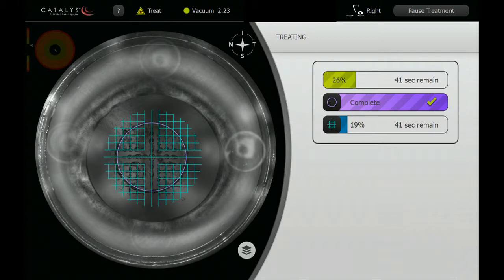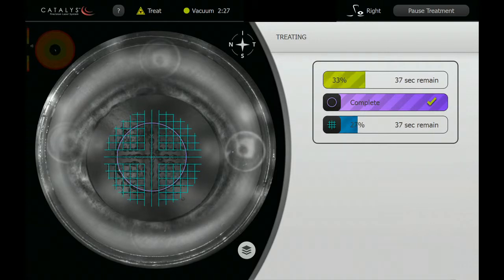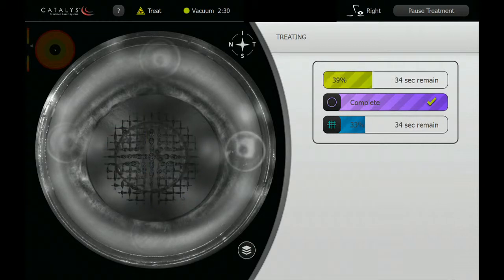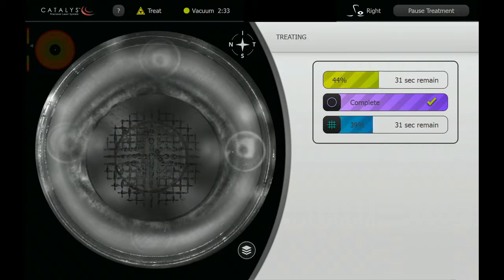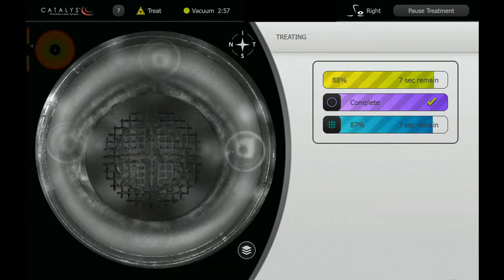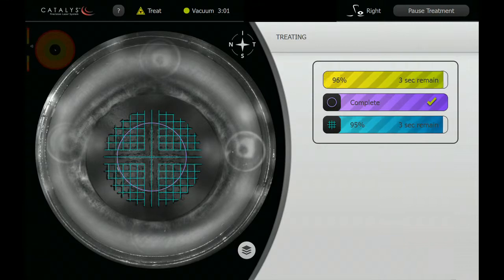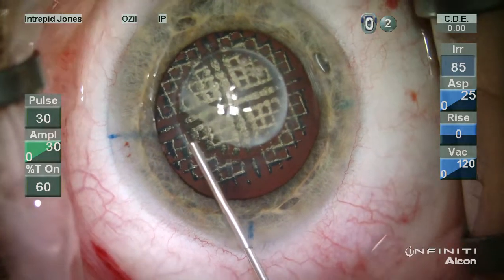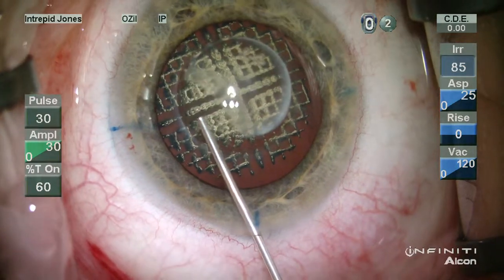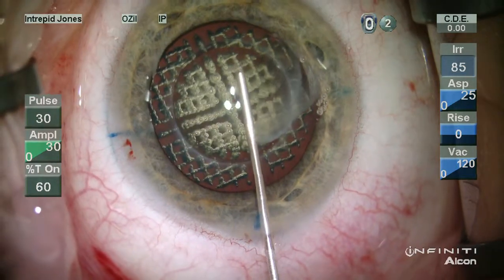Then the lens softening and lens fragmentation is applied, during which we can note the evolution of a three-dimensional array of bubbles, which are trapped within the soft lenticular material. These bubbles largely follow the pattern of the softening and fragmentation areas.